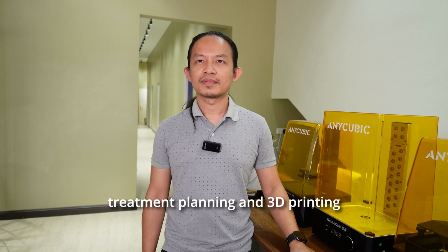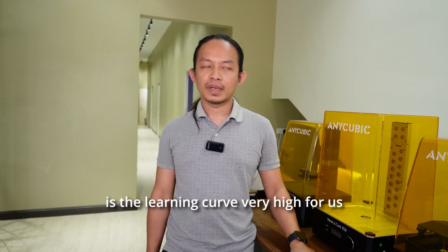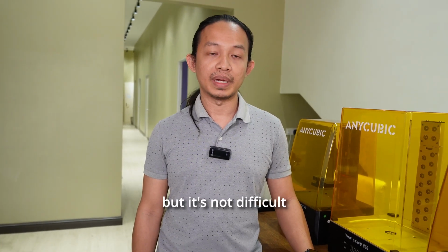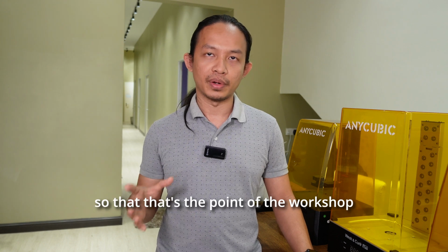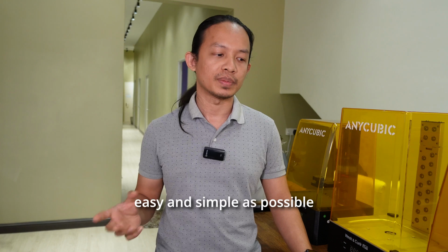All this treatment planning and 3D printing, we will need software, right? So what is the cost of the software? How expensive is it? Is it very difficult? Is the learning curve very high for us? I'm not going to say that the software is easy to use, but it's not difficult once you know and understand how it works. So that's the point of the workshop. We wanted to make it as easy and simple as possible.